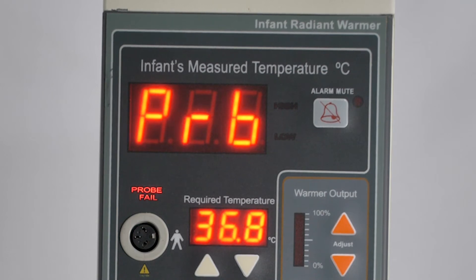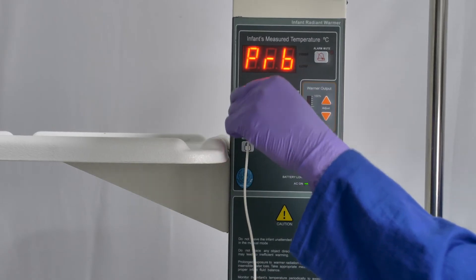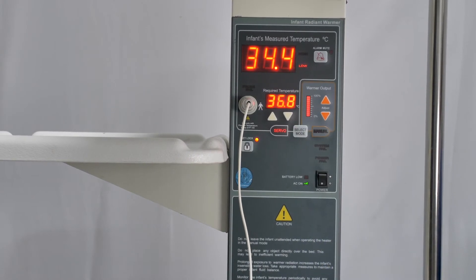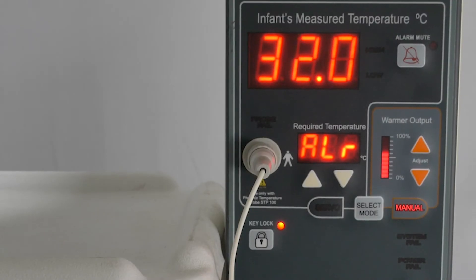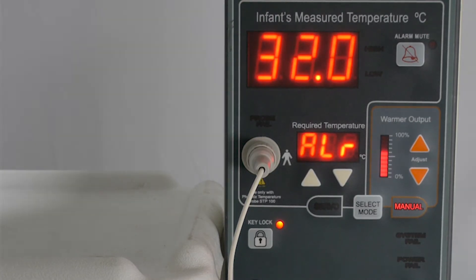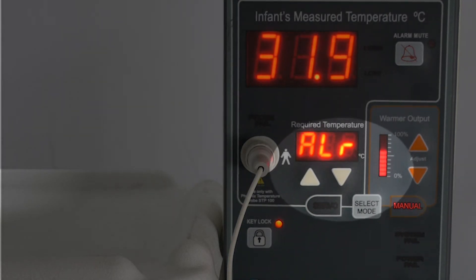If the probe is not connected or working, that will set the alarm off with the abbreviation PRB for probe failure. If there is a mains power cut, the alarm will also go off. If the baby's temperature goes too high or too low while in manual mode, then the alarm will go off with the abbreviation ALR for manual mode alert.